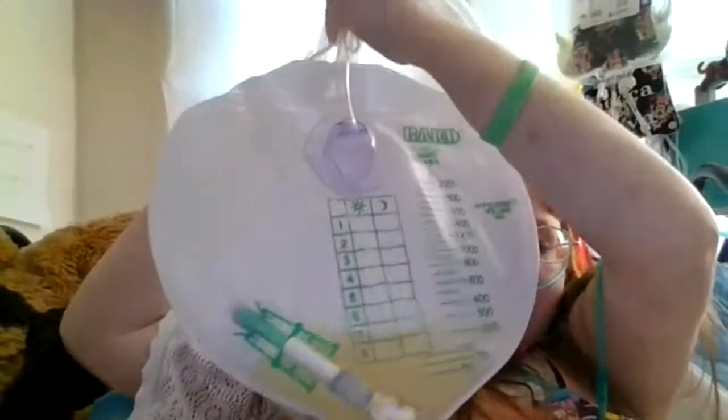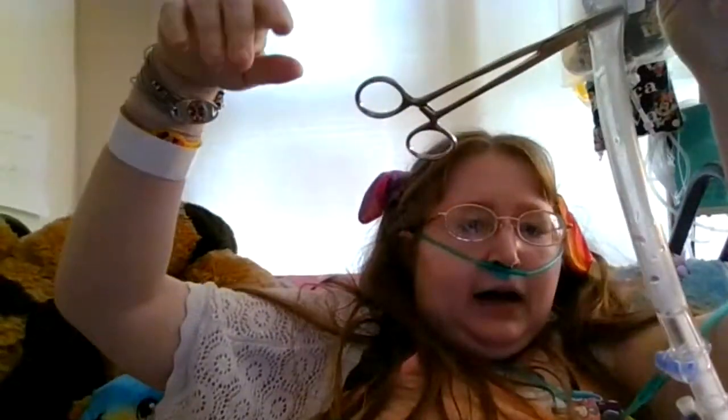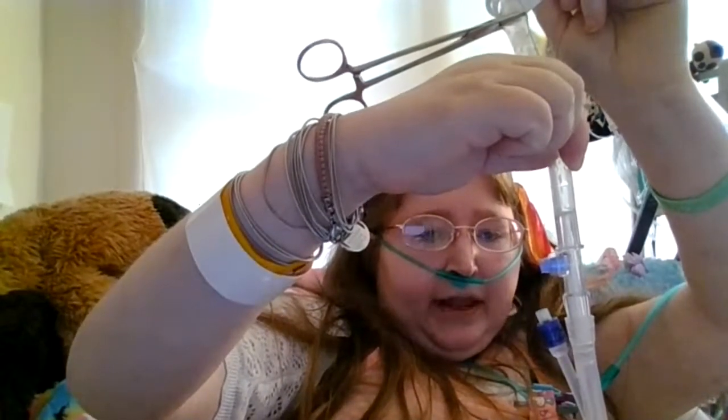The bag has just been emptied so you can't really tell, but I have it clamped off in two different spots. We're going to attempt to draw urine out of the catheter bag right now and see if we've had it clamped off long enough. If we have, we'll be able to draw a urine sample and send it to the lab.